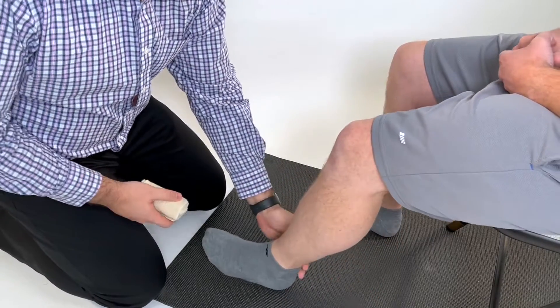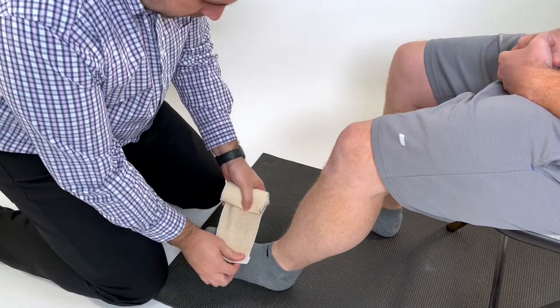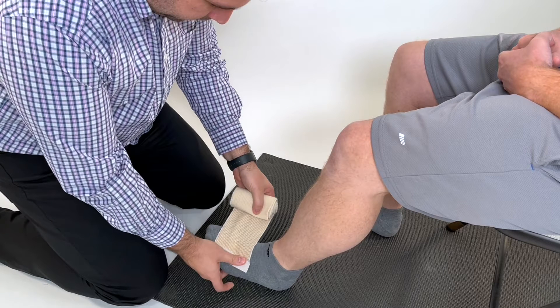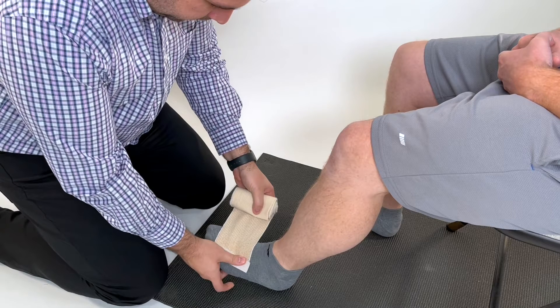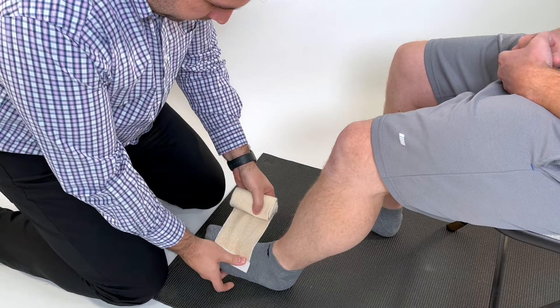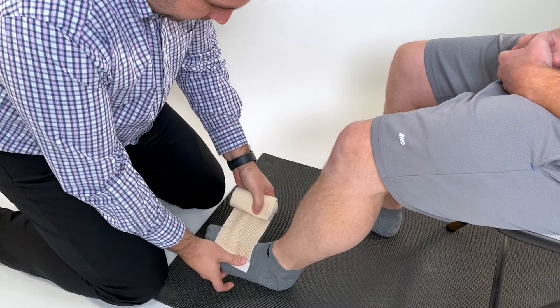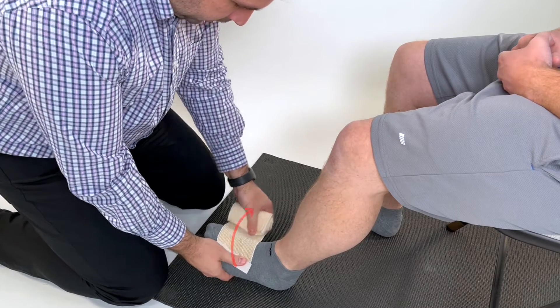Begin with the patient seated and bring their foot into dorsiflexion. These patients generally need help with pronation, therefore begin by wrapping the ACE wrap at their midfoot, starting at the top of the foot going from lateral to medial.